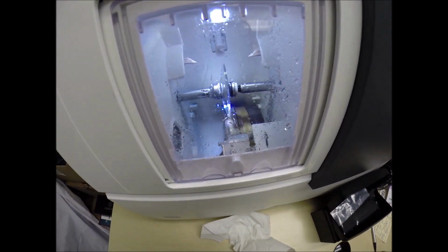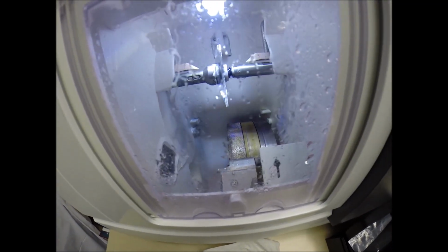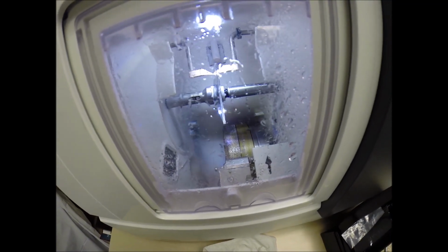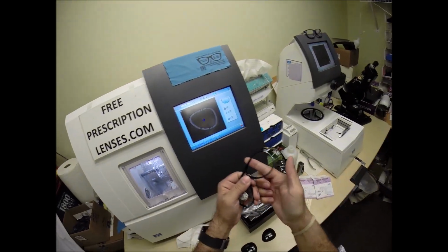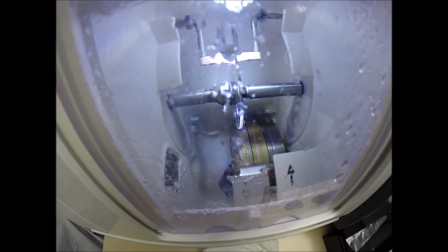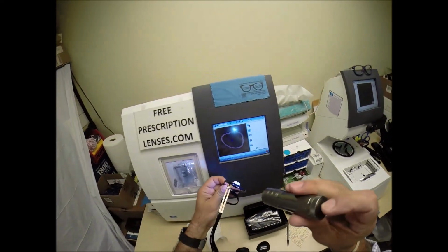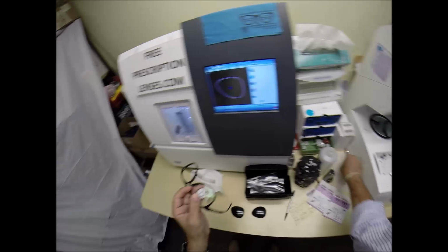The door closes, the clamp shuts. Just like before, the 2 white styluses are going to trace the shape of the lens, making sure the lens is large enough to fit into the frame, and you can see as it's going around tracing that shape. And just like before, the old carpenter saying measure twice, cut once, it's measuring the thickness of the lens at every point to know exactly and precisely where to place the bevel so you have the least amount of edge thickness showing, of which you got none.